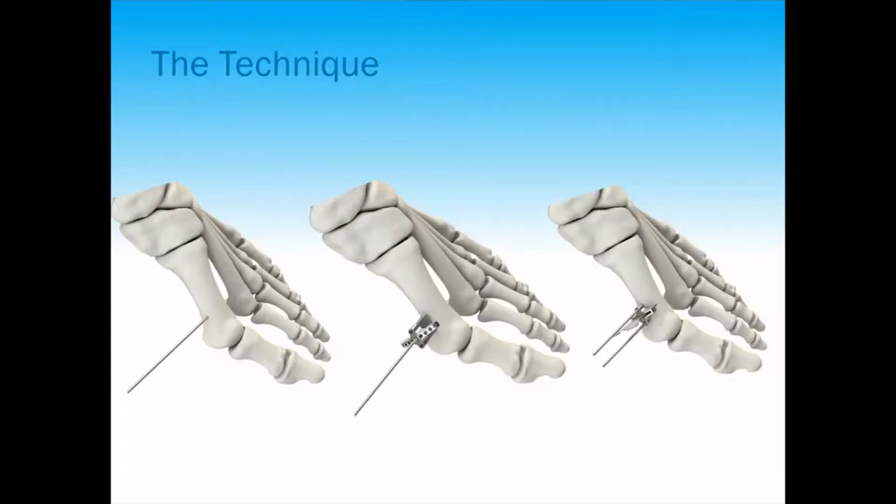So this first guide allows you to do multiple drill holes. You can see all the drill holes here. So you could create multiple drill holes at the neck level and then do your osteotomy with an osteotome with this second guide you see on the right-hand side of the screen. So you can either insert an osteotome or a saw through that guide.